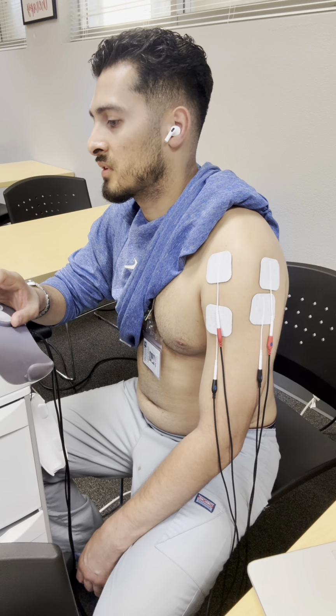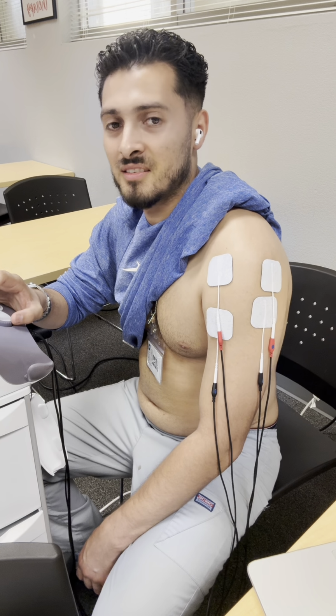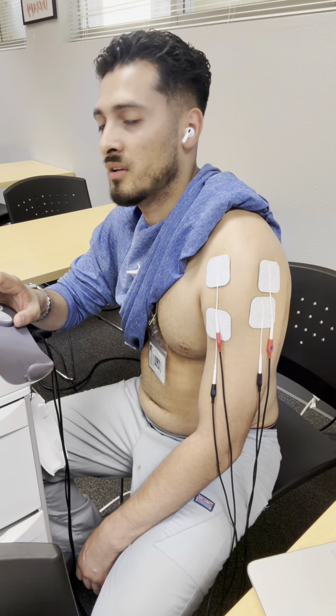Ooh. Yeah, I didn't lower the intensity on that one. You can definitely see a lot more activity going on with that one.